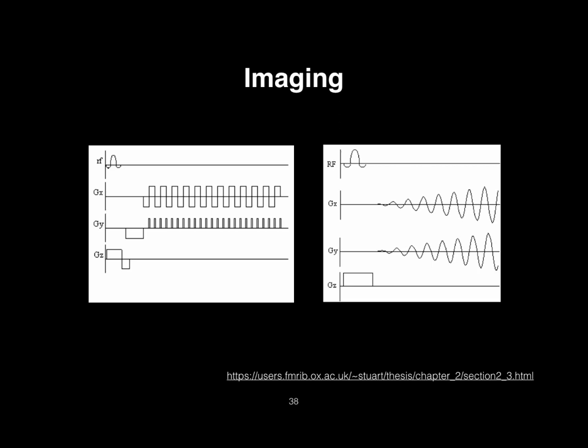But it turns out that if you actually look at their effects in K-space, this is actually also doing a little bit of encoding in KZ with our RF that we unwind and essentially bring back to the middle of K-space. And then what we do with our gradients here is we move these off in the different dimensions of K-space and walk through and acquire when we need to acquire. So essentially the role of the gradients is to move your signal, your magnetization, through K-space.